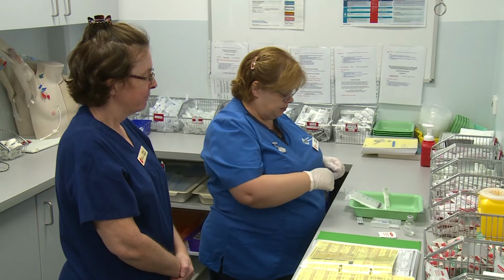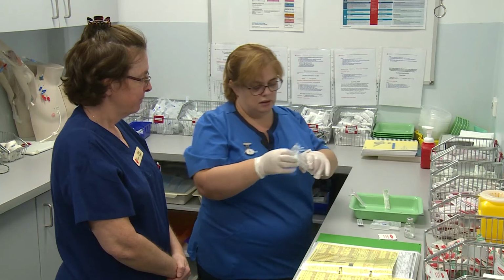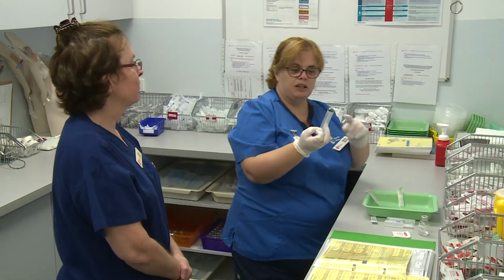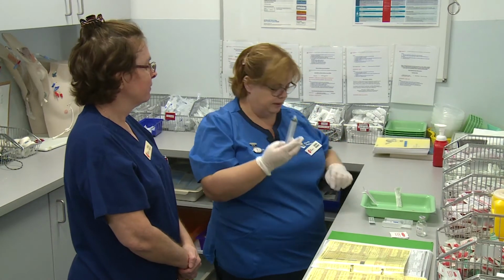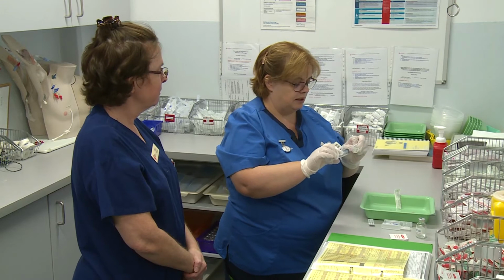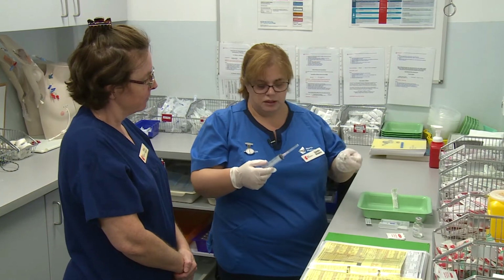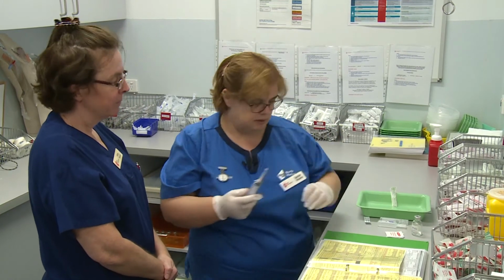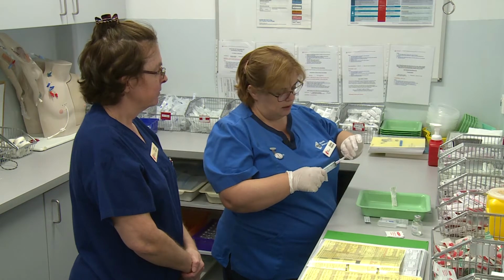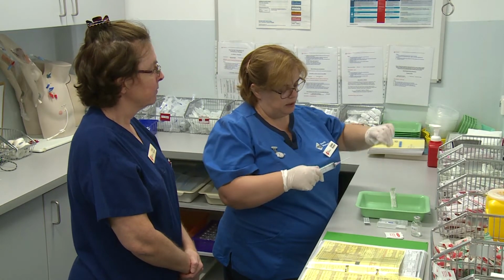And while that's drying, I'm going to assemble my syringe. All the time I'm making sure that I don't touch my key part. Now that's my key part at the top. And again, I'm going to connect to my drawing up needle without touching my key parts. Okay, so now that's done, I'm going to take my cover off my drawing up needle.